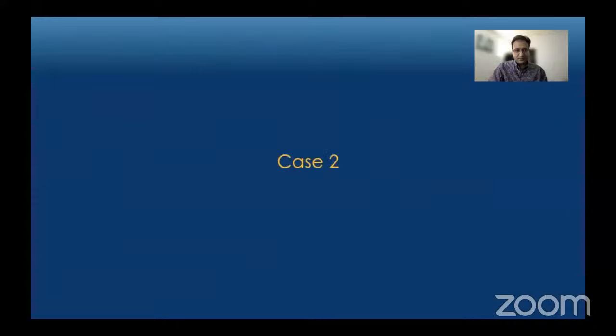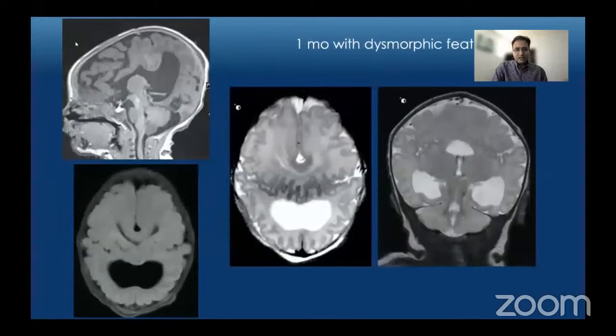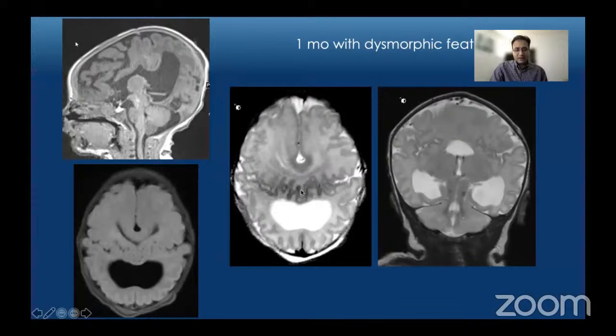Moving to case number two: a one-month-old child with dysmorphic features. On axial T1-weighted images we see abnormal fusion of the cerebral hemispheres across the midline. The inter-hemispheric fissure is partly present anteriorly and a small portion posteriorly, but obliterated in the midline. There is continuation of gray and white matter across the midline, as well as an abnormally long sylvian fissure extending across the midline over the vertex onto the contralateral side.